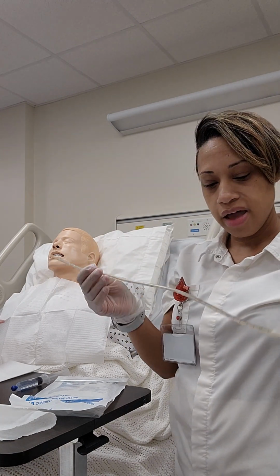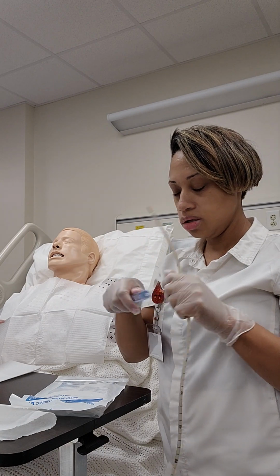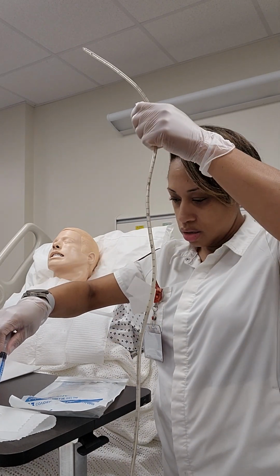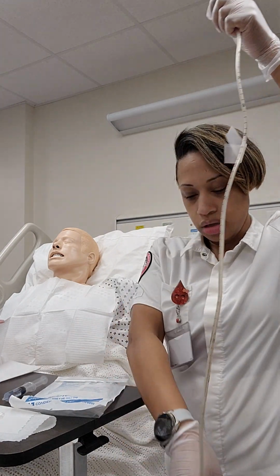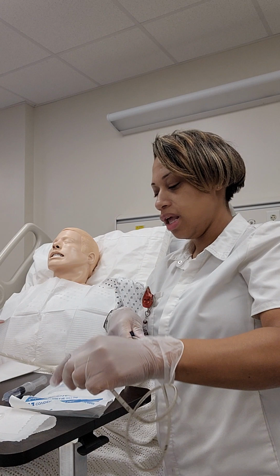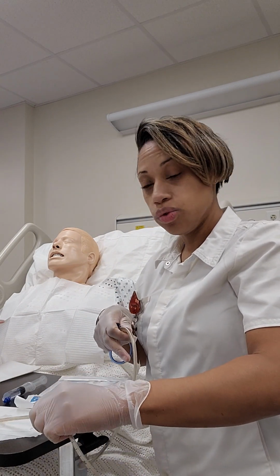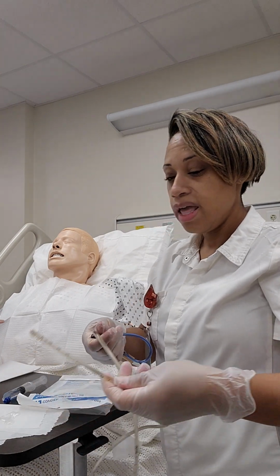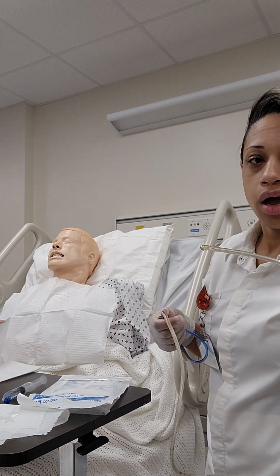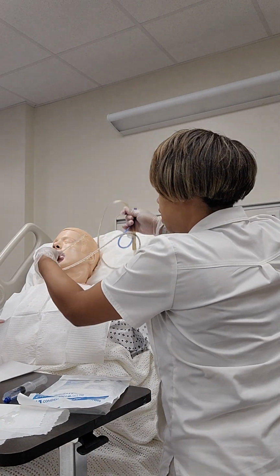Now once I have that placement, I will get my water soluble lubricant. I'm not going to have that dangling, but I'm getting my water soluble lubricant, and I'm going to lubricate this for up to 3 to 4 inches, and then I will start inserting the tubing.